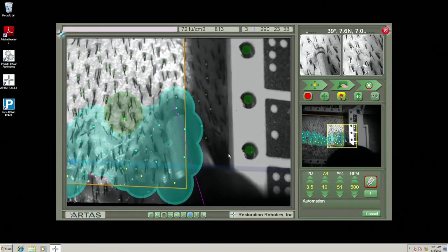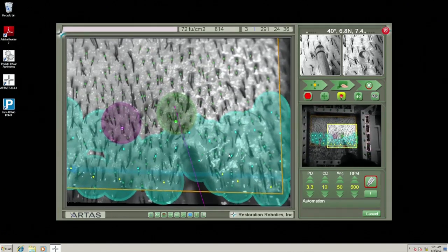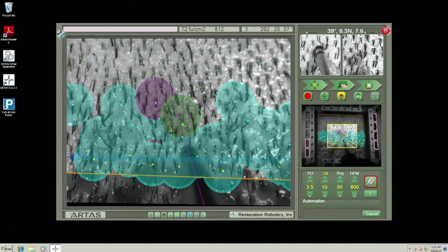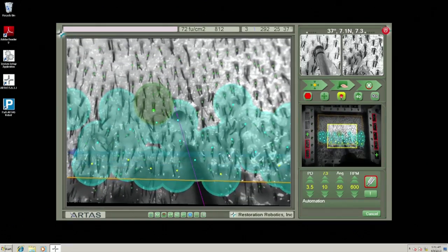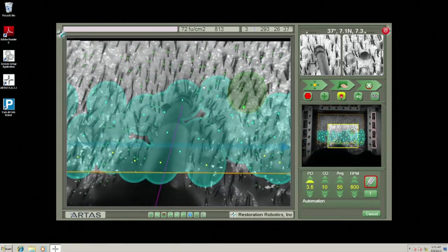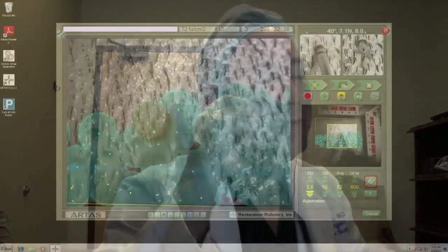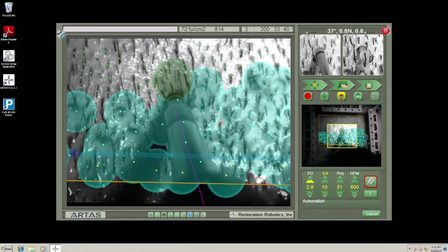That number sometimes can vary, starting at 1 cc of normal saline. If we have a lot of bleeding or oozing in somebody who's very vascular, or maybe on aspirin, or maybe even somebody who has a lot of curry in the diet, those can have antiplatelet effects. Then we'll oftentimes use a little bit of epinephrine. I do use epinephrine in FUE cases. Some people, such as Dr. Bernstein, will not. He tries to avoid using epinephrine. I haven't seen it be a major factor in our growth. So 1 to about 3 cc's of tumescent per grid is sufficient.